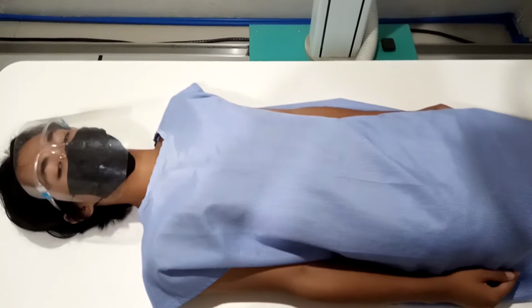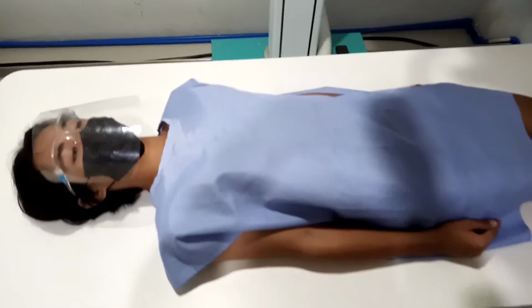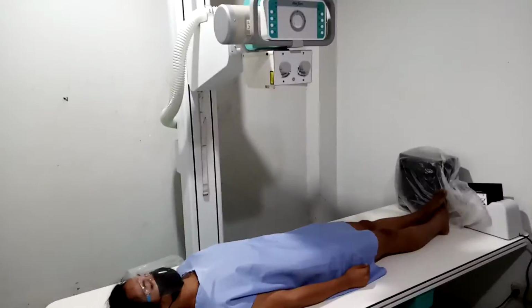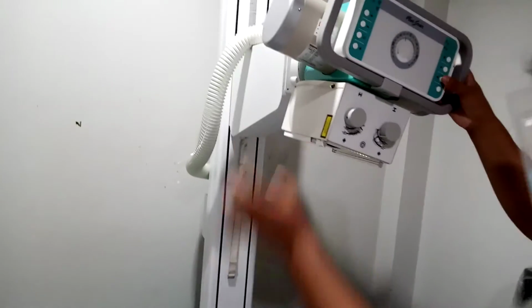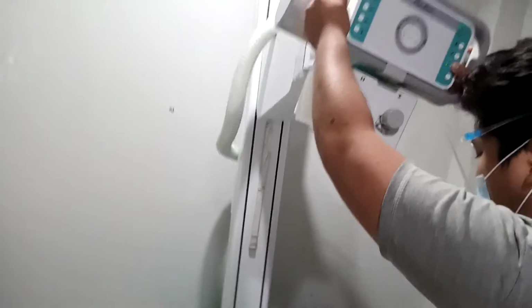Then the central ray must be angled 15 to 20 degrees cephalad, entering slightly inferior to the thyroid cartilage and exiting C4. So, cephalad, just below the thyroid. So, can we do this one, sir?